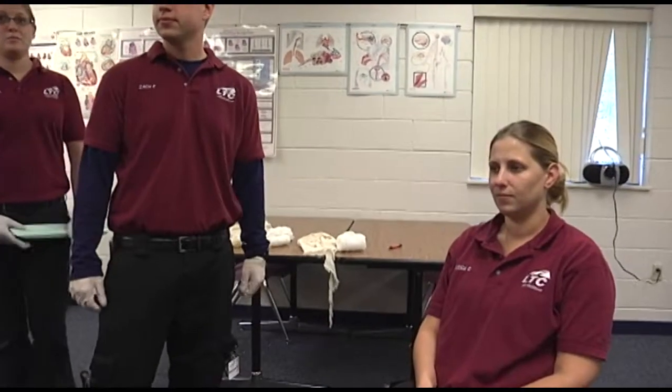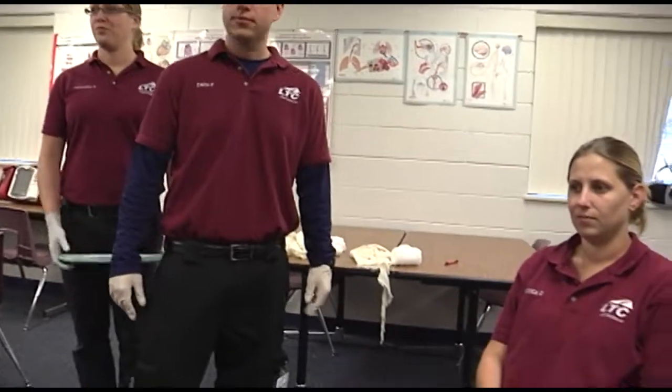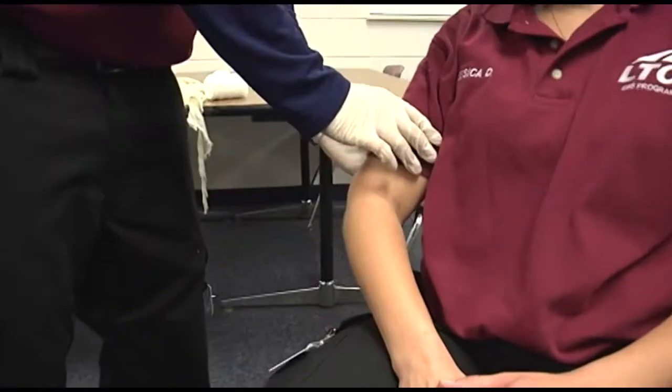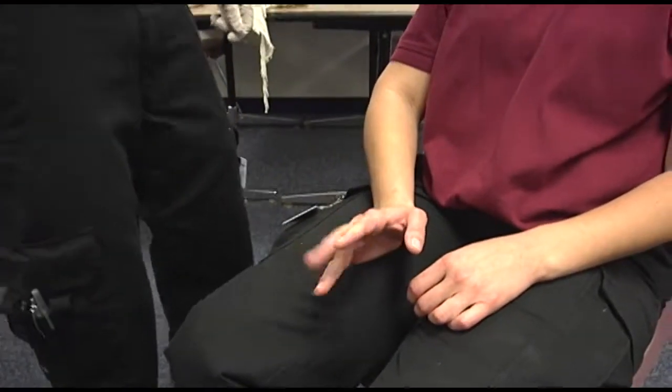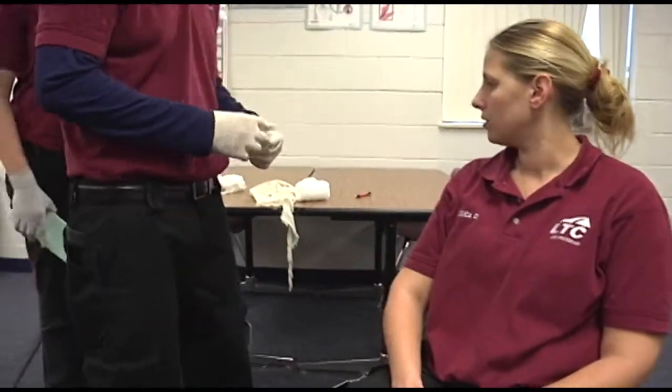Takes the appropriate body substance isolation precautions, performs the appropriate patient assessment for the scenario. Cover any open wound with a sterile dressing and control bleeding, and support the fracture during the process.